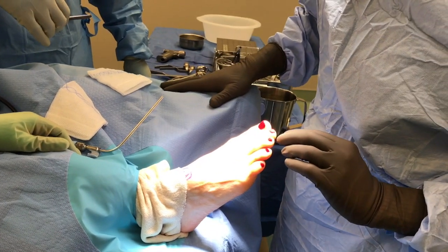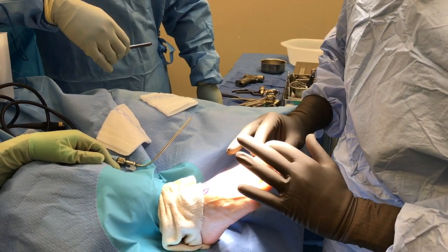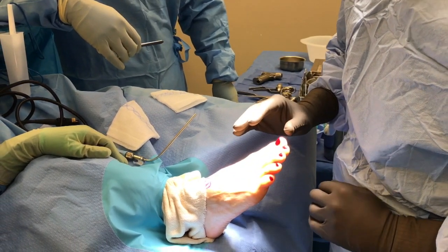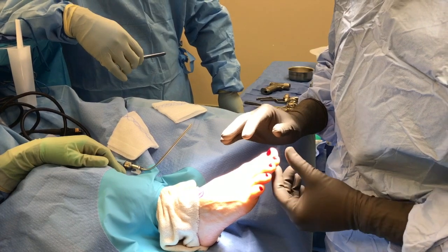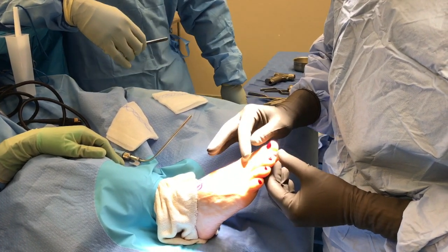We have performed the same surgery on her left foot, and now, about six months later, we're going to perform it on the right on digits 2, 3, 4, and 5. We're also going to use a new pin that goes down the medullary canal, or the bone marrow, that keeps the toe straight.